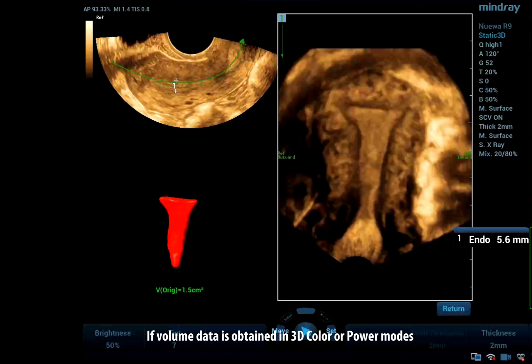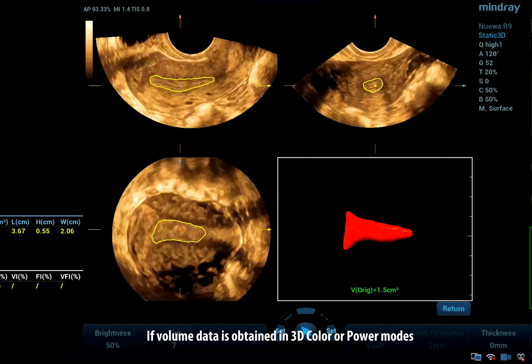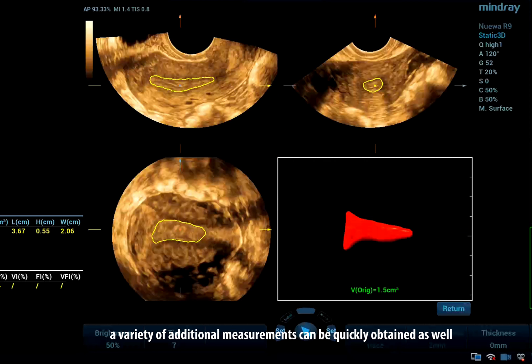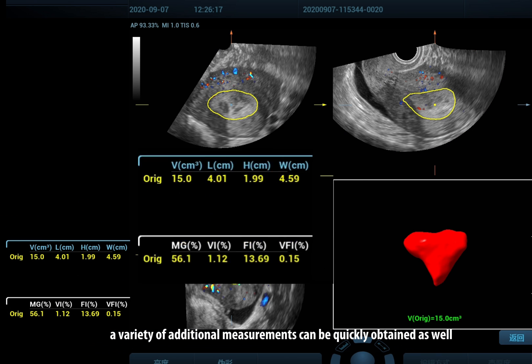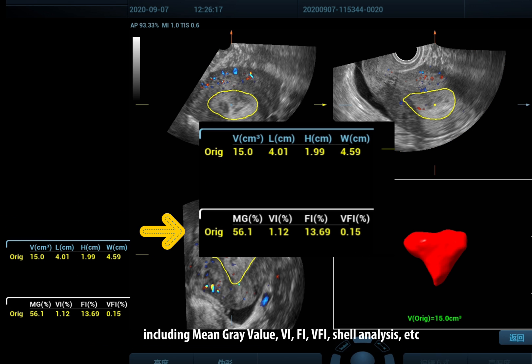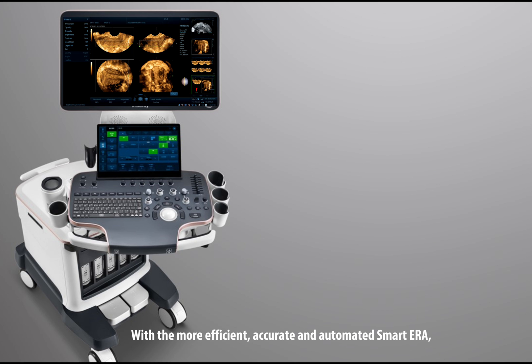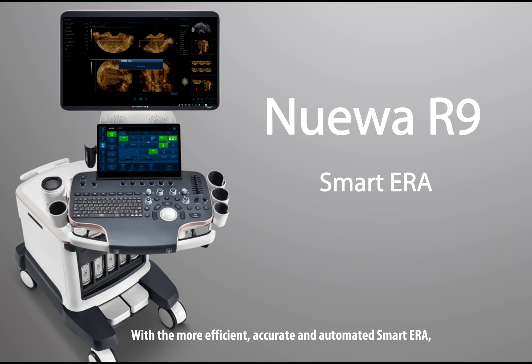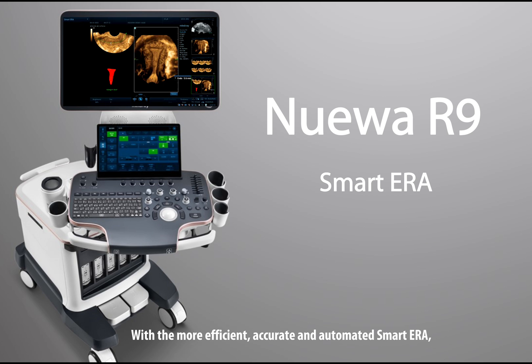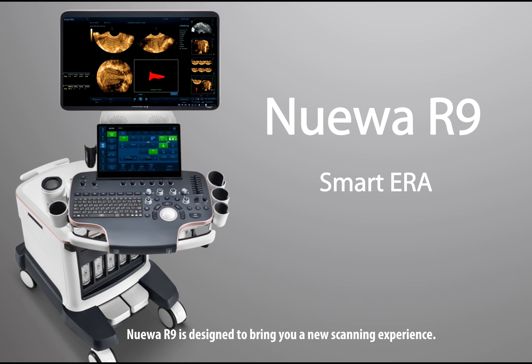If volume data is obtained in 3D color or power modes, a variety of additional measurements can be quickly obtained as well. With the more efficient, accurate and automated Smart ERA, Nuewa R9 is designed to bring you a new scanning experience.